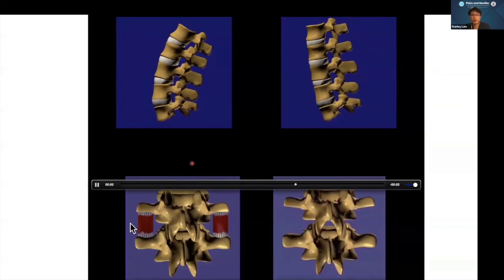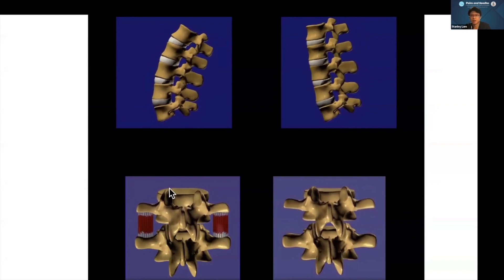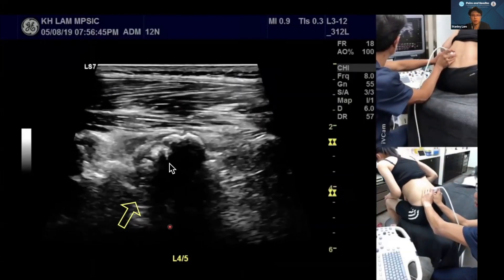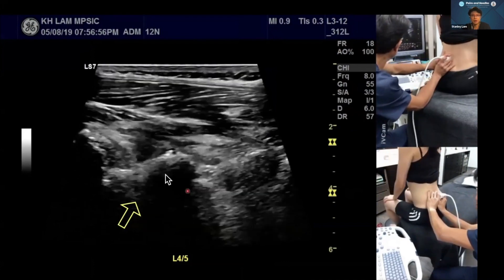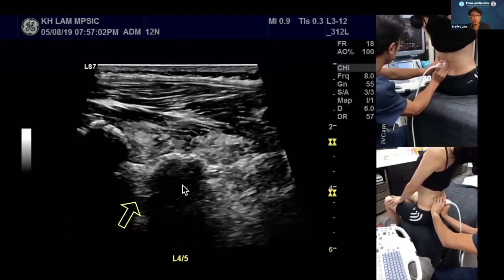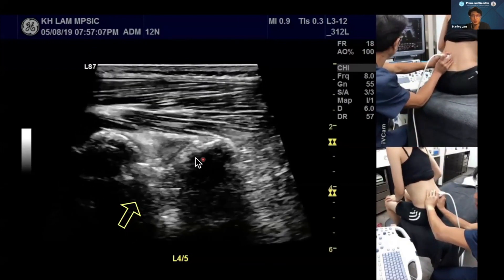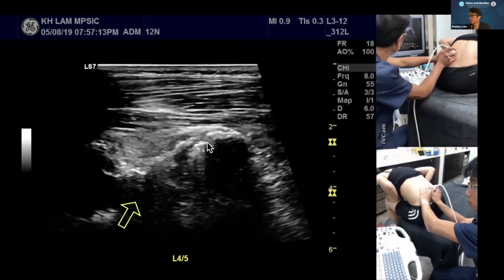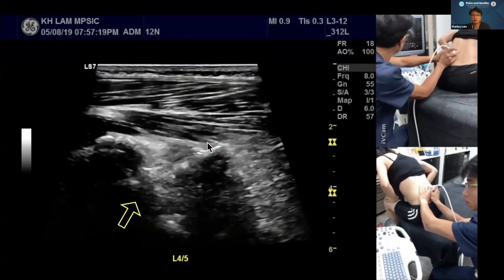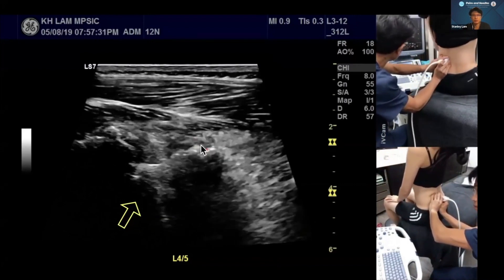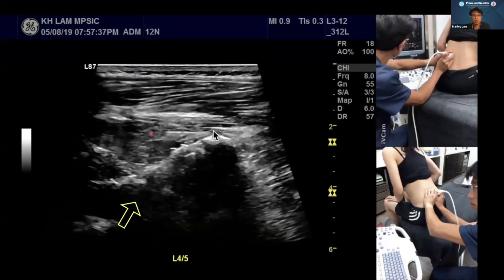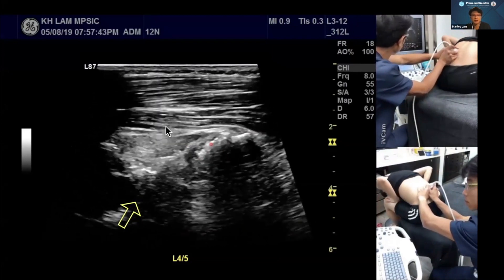When you ask the patient to bend forward, you are opening the facet; bending backward closes the facet. FRS dysfunction means the facet is stuck in flexion. When I ask the patient to bend forward, I can see debris between the superior and inferior articular pillars and some fluid. If not treated well, the patient will develop facet cysts, eventually osteophytes, and could no longer close the facet. Pay attention to the multifidi covering the facet — you'll often see derangement in the striated pattern of the multifidi.